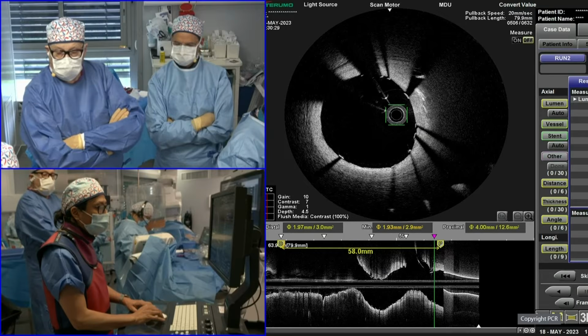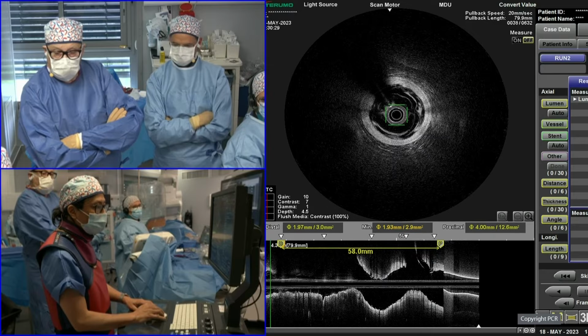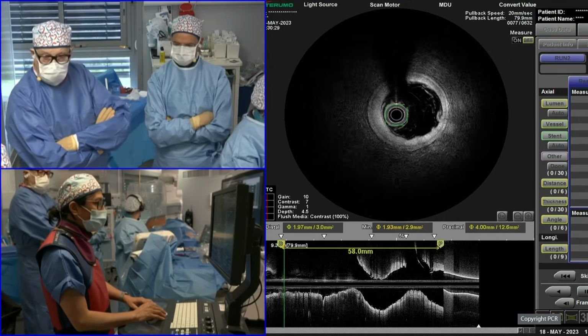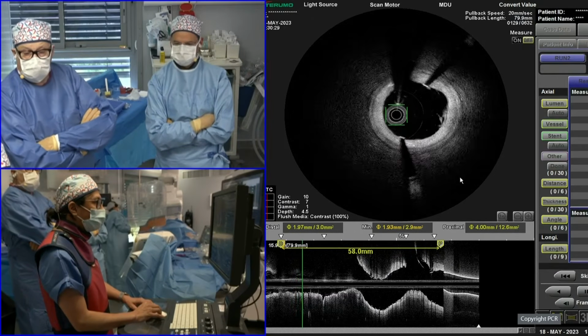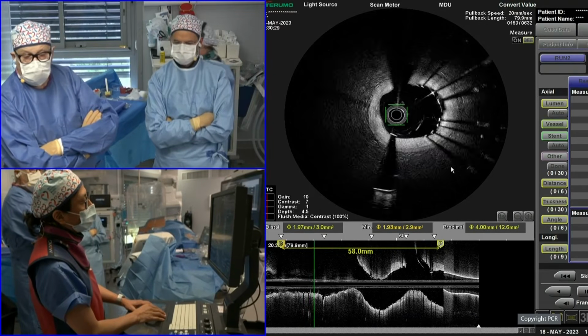Perhaps now it's worth reminding you what we are looking for. First we should start with the distal part of the stent and check two things: whether there is any dissection, especially paying attention to deep dissection going to the media on a longer stretch of the vessel, and the second thing, what's the plaque burden? Plaque burden should not be more than 50% of the vessel area.